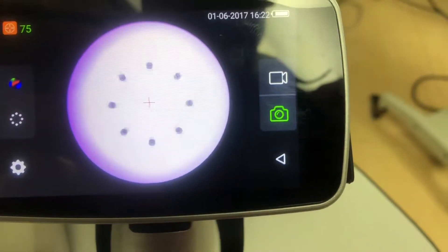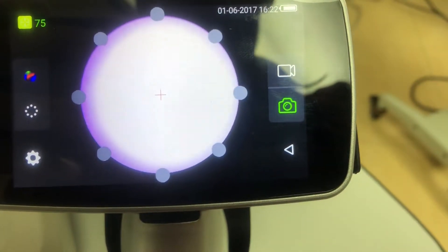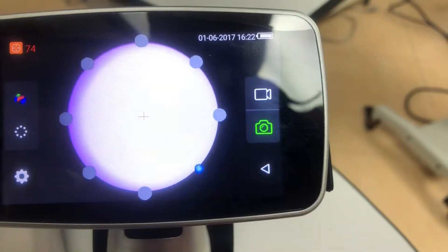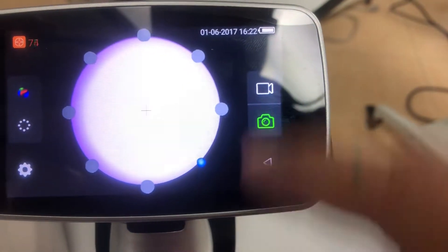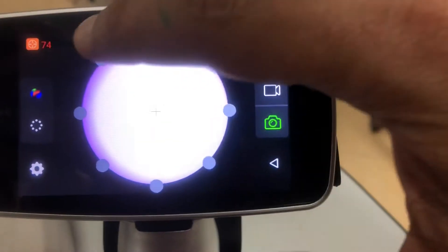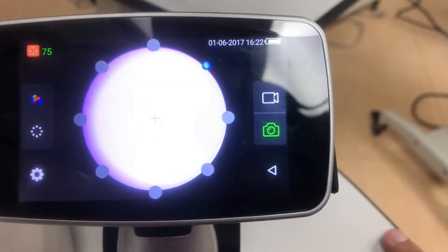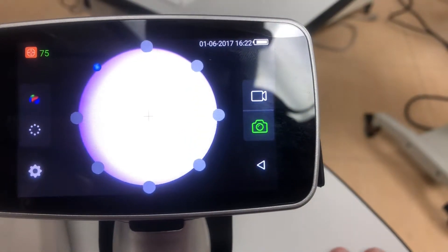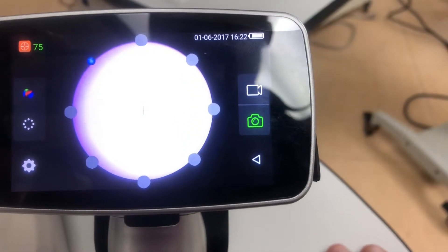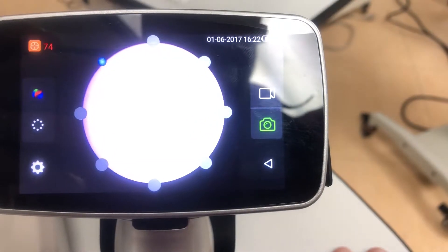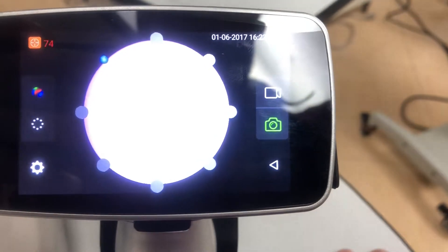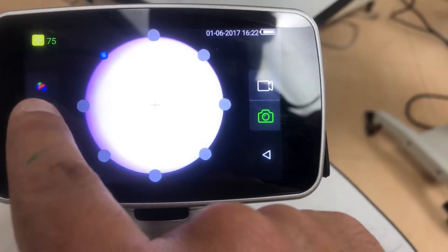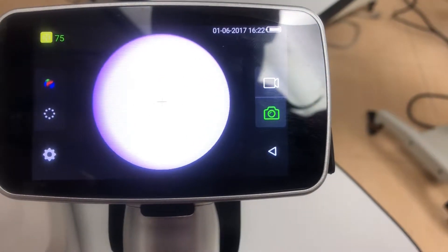The next setting is your fixation. These are points of fixation — if you want to select one, you just got to tap on that screen to let the camera know where you want to fixate. There's a light on the other end where the patient sees, and they just have to follow it. If you want to remove the fixation, simply push that button again.